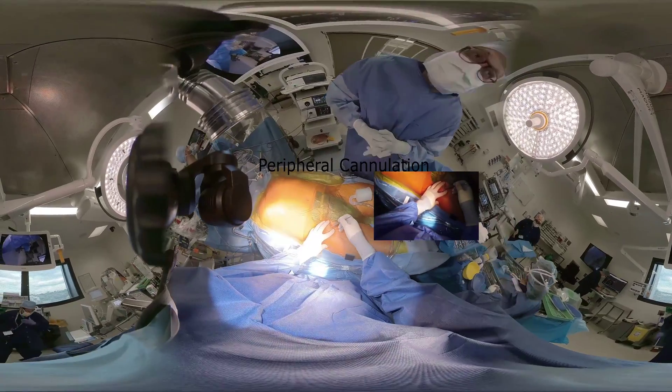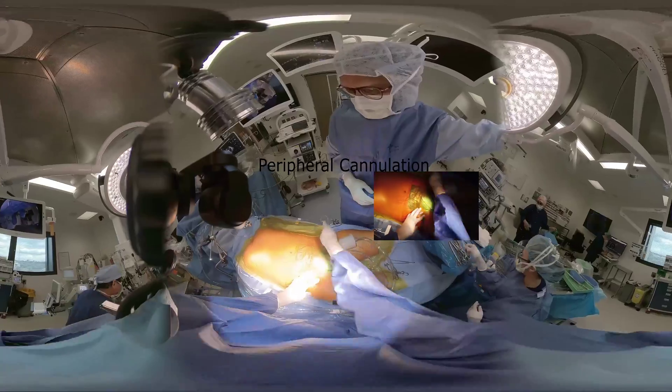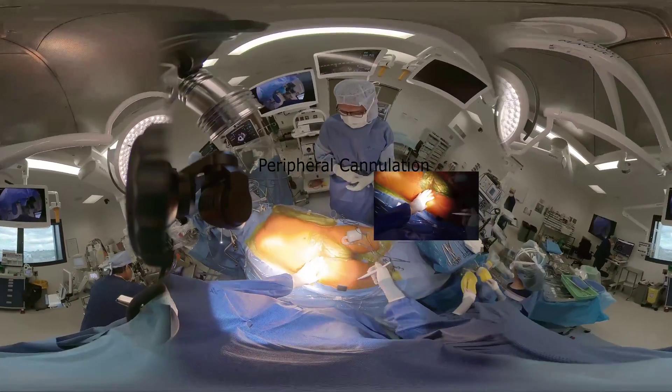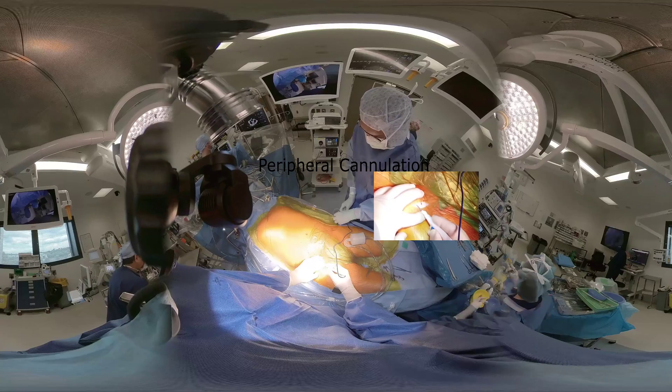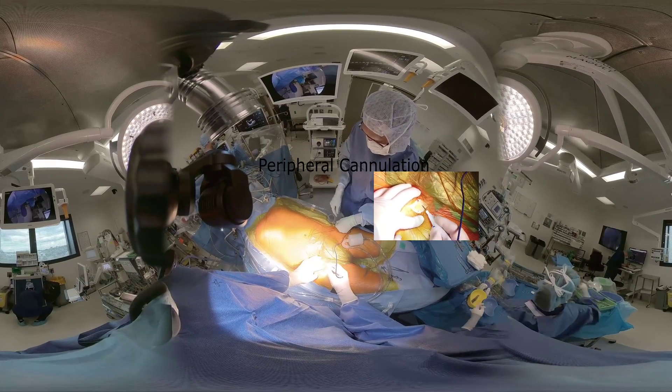The right femoral vessels are cannulated. Access to the vessels is obtained through a 3–4 cm incision just inferior to the inguinal ligament, at the point where they tend to run parallel to each other.